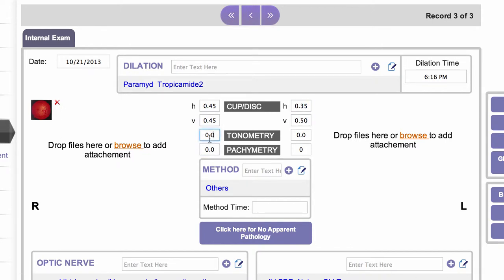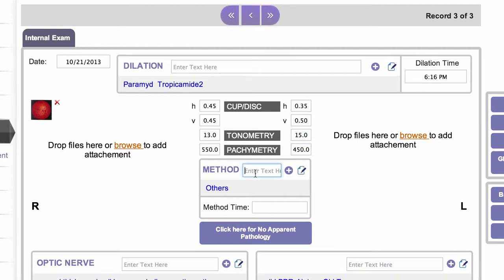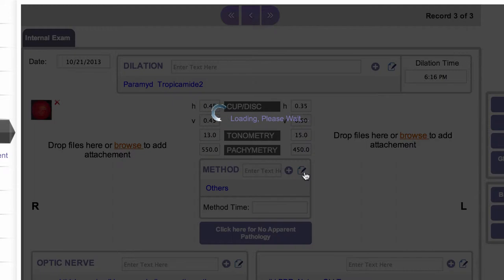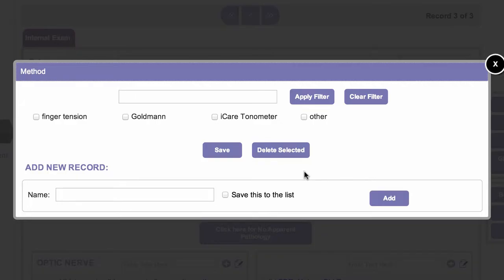Next would be your tonometry readings, and of course you can put these in here for right and left, along with pachymetry readings. Method is the next text box down, and here you would add the method that you use to obtain the IOP readings. You can type something in here or you can have a list of the types of tonometers you have in the office that you may have used.